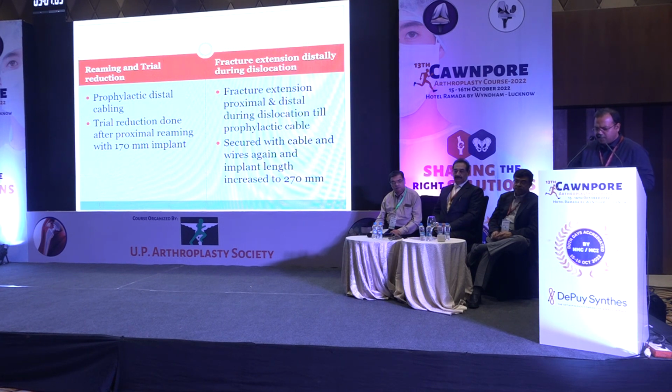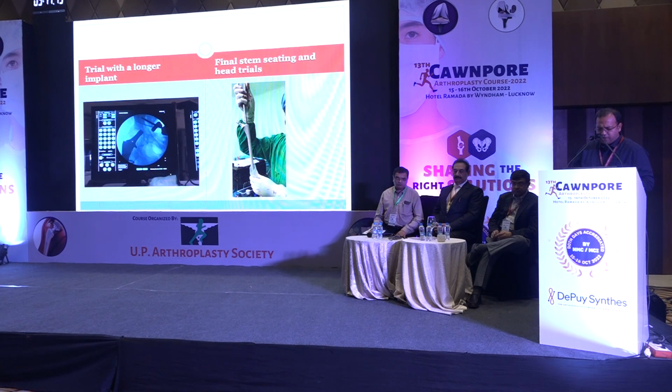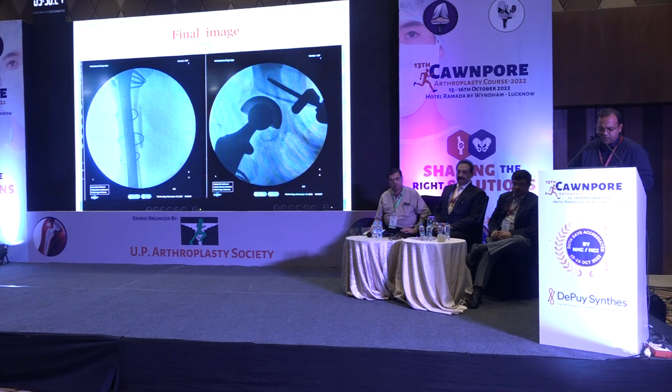If you can see, this is a plate we had held on to earlier. If you can see, this is a fracture which was propagated. And we used more cables to pull it up. And then we put a revision stem. We reduced it and did a trial reduction so that once you put the stem, we're not left unable to reduce it back fully. And then this was a final reduction.